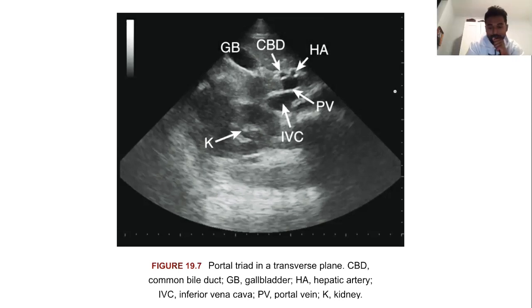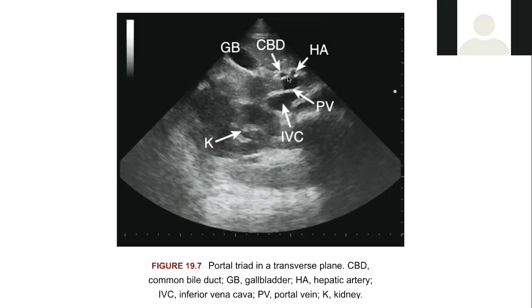No worries, man. Are you talking about the aorta? Would the aorta be all the way over there? No. Are you talking about the IVC right there? Yeah, the inferior vena cava would be there, right?